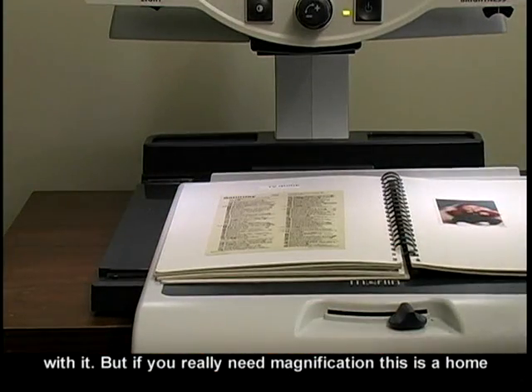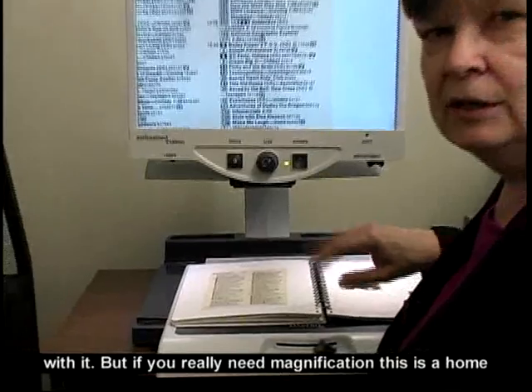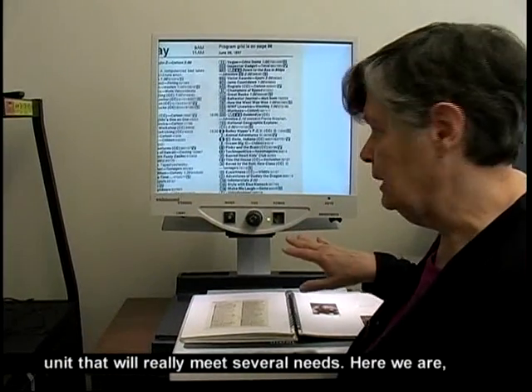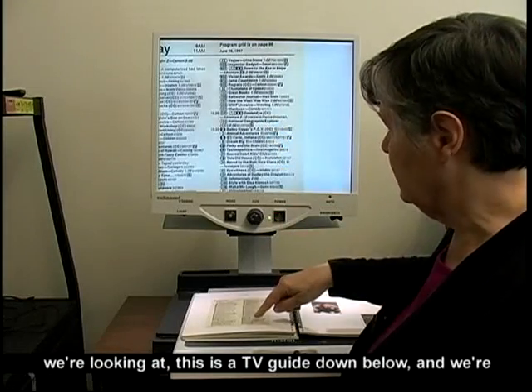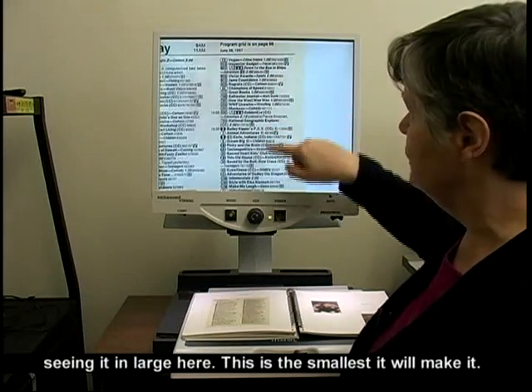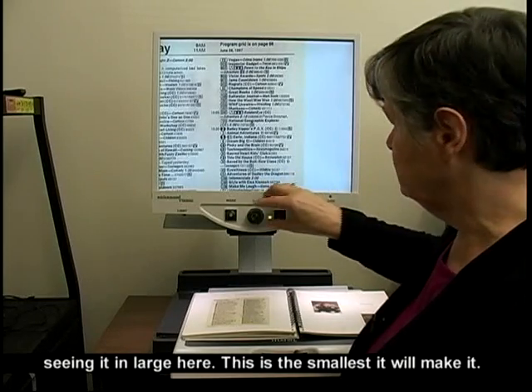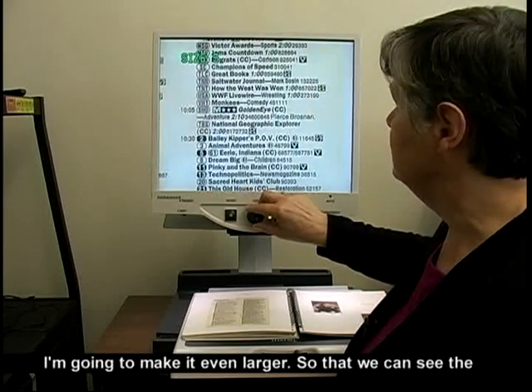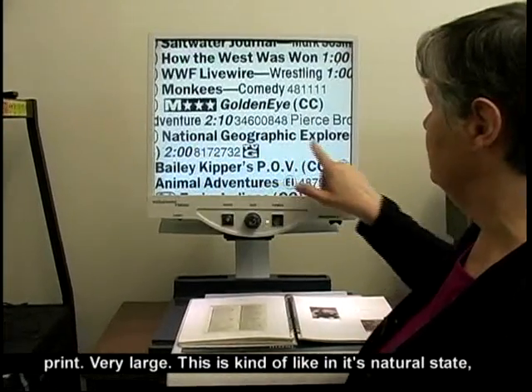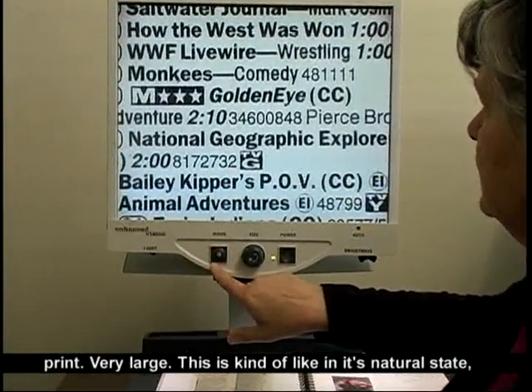But if you really need magnification, this is a home unit that will really meet several needs. Here we are — we're looking at a TV guide down below and we're seeing it enlarged here. This is the smallest it will make it. I'm going to make it even larger so that we can see the print. Very large — this is kind of like its natural state.